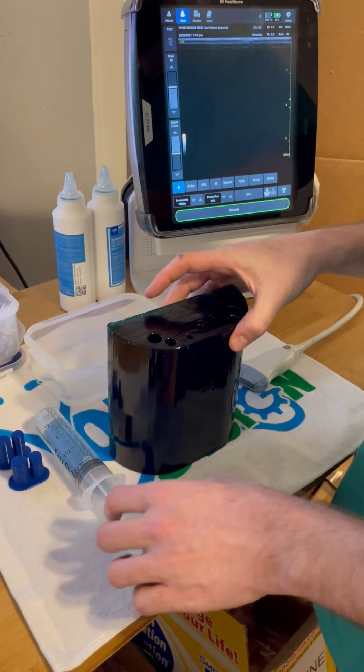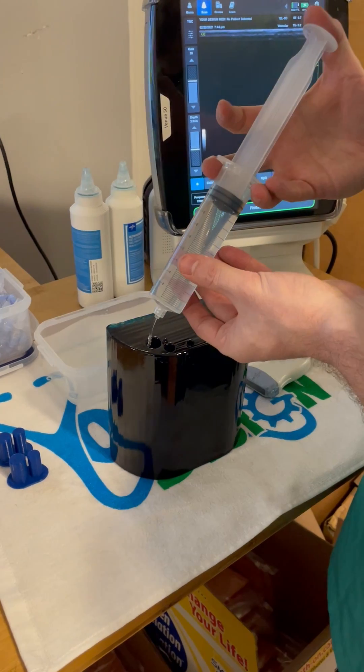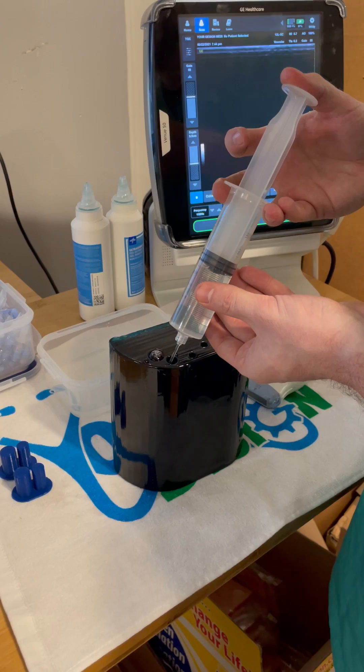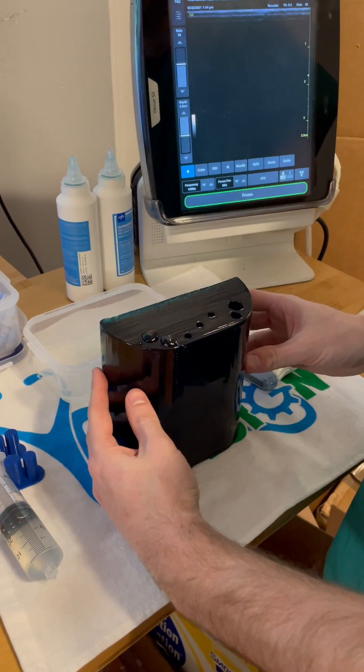First we're going to show you how to use the Central Line Training version. Point the open holes up and fill with whatever fluid you want — water works just fine. You can then lay it back down slowly.